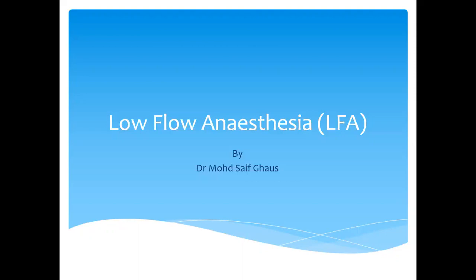Whenever I see this topic, it takes me back in time to my residency, which I started in 1998. In those times, high flows were the norm. We would be working on the Boyle's basic machine with flows of 4 liters, 6 liters, 8 liters and like. As I look back, I realize how times have changed, from 4, 6, 8 liters, now we are down to 500 mLs or 1000 mLs and maybe even 250 mLs.